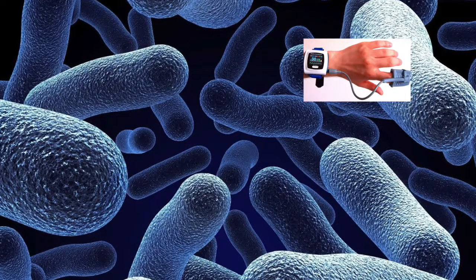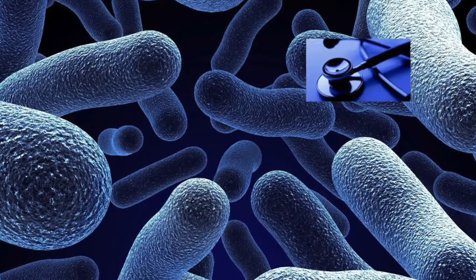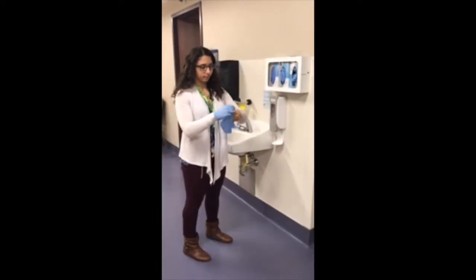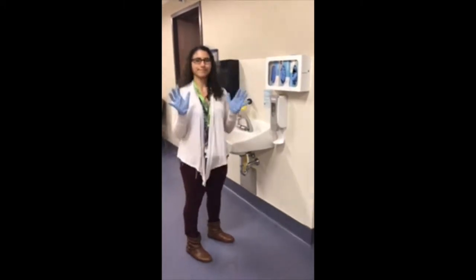These include pulse oximeters, thermometers, blood pressure cuffs, and stethoscopes. Before entering the patient room, be sure to perform hand hygiene. Then, putting gloves on, clean each piece of equipment following the hospital's patient care equipment cleaning protocol.